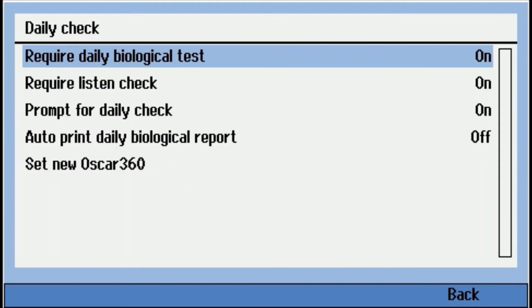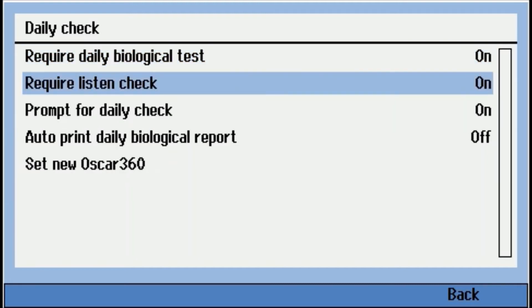You can require a listening check. And the prompt for daily bio would mean as soon as you turn on the audiometer, if it hasn't been run, it's going to let you know you have to run this before you can do anything. Auto print daily bio report. So there's a printer kit that you could set this up to just automatically print as soon as you run the test.